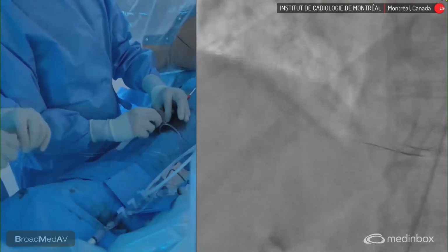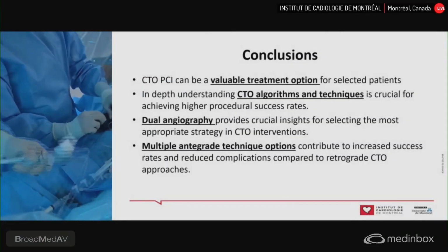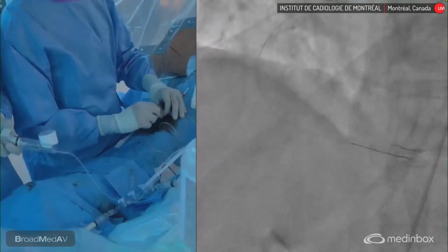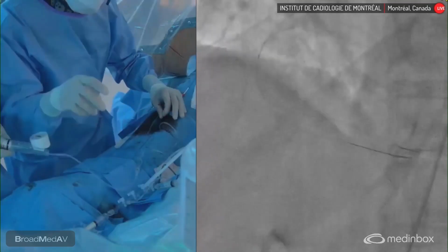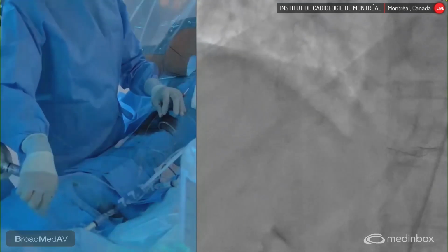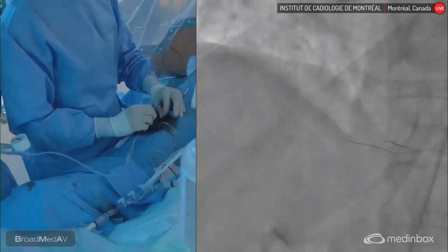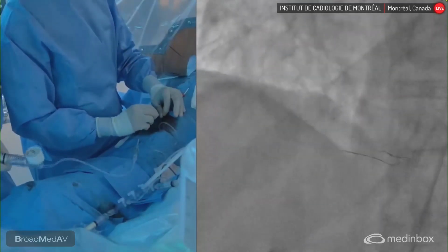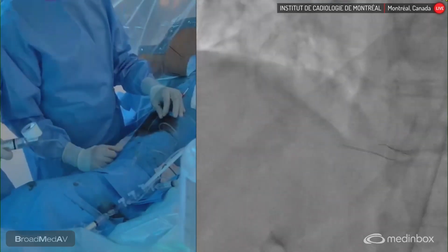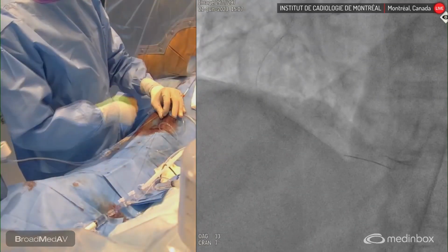So do we know if it's going to cut soon? If so, we'll just go to our slides and leave you guys with some conclusions. So, of course, if you guys are not lucky enough to be scrubbed with Dr. Nozer, who actually succeeded at passing this wire, made this look so easy that you want to give it a try immediately, but you need to be ready to do any other type of technique if you have to. So success rate is actually dependent on being able to go to the next step and eventually plan for whatever you need ahead of time.